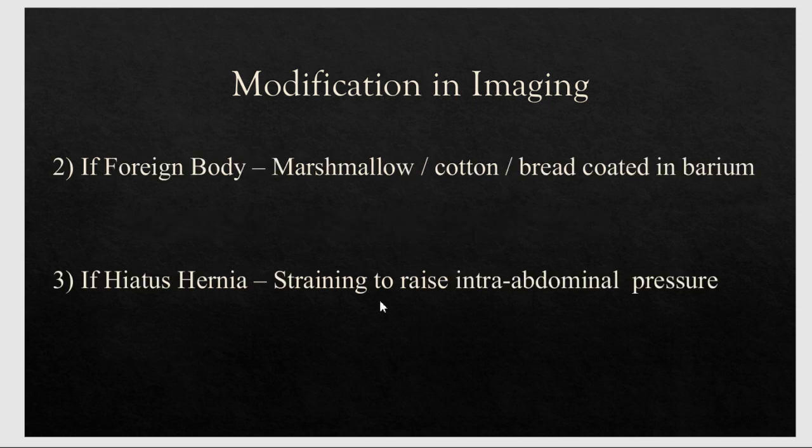If we are suspecting a foreign body, instead of giving barium suspension, a marshmallow, cotton or bread coated in barium is the thing we must use as contrast material. The rest of the things are almost the same.